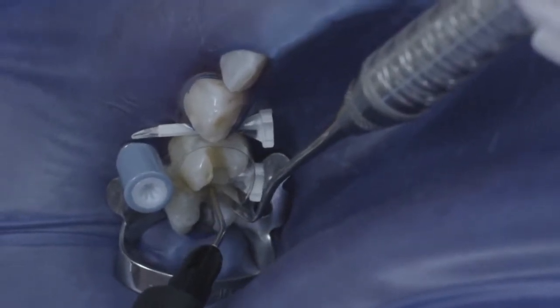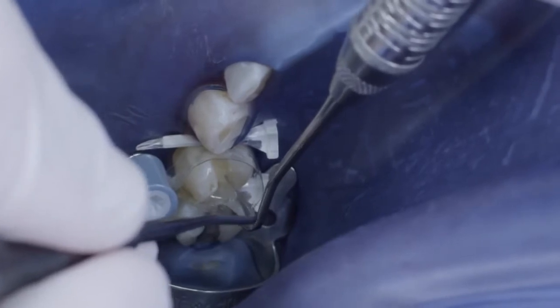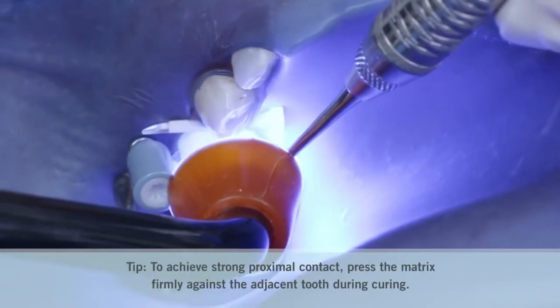To prevent air bubbles from becoming trapped, it is always important that the cannula remains within the material during application. Venus Bulk Fill was cured for 20 seconds.